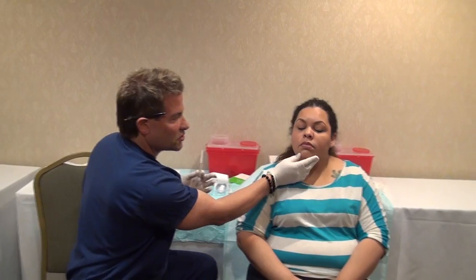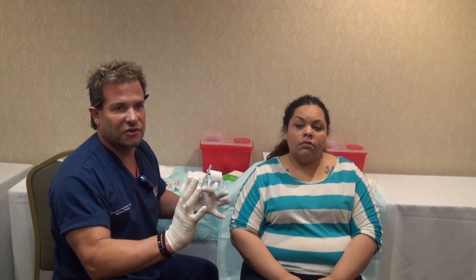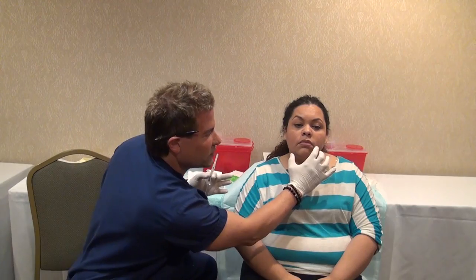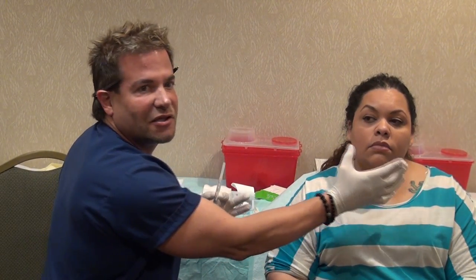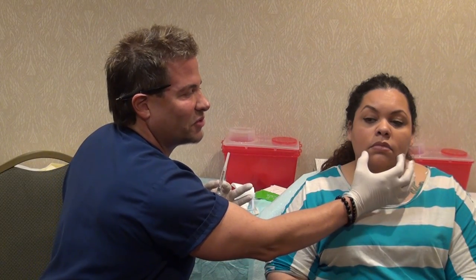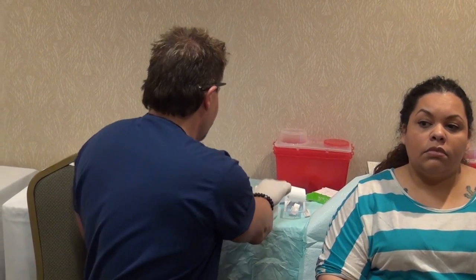We're looking for a subtle change — just for demonstration purposes, we're not going to overdo it. We're going to inject a little bit right over here at the corners of the mouth. It's a nice technique because it fills in that area and can also bring the corners up a little bit. Another technique you could use is injecting the DAO muscle — the depressor anguli oris — with Botox, which brings the corner of the mouth up. Used in conjunction with filler, you get a very nice result.